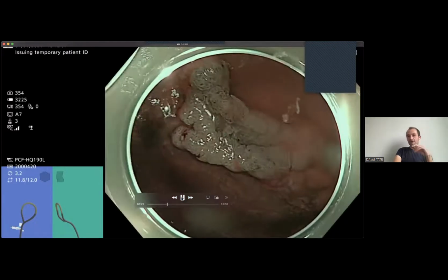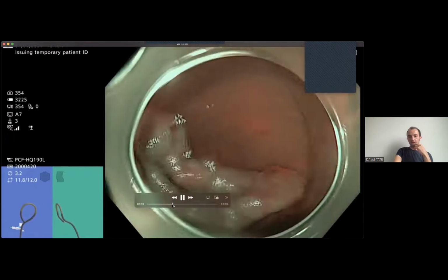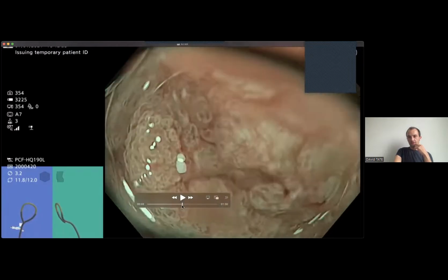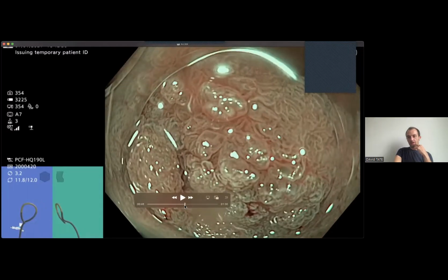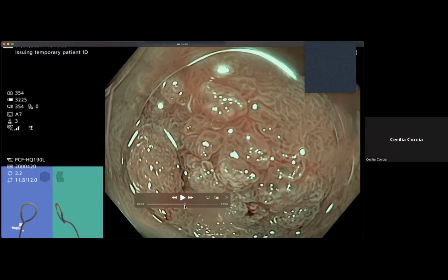Anyway, indeed we need to further image the part which looks like a depression, which could be a demarcated area. So let's get a little bit closer to that. I might just skip the video a little bit to see it. So the endoscopist obviously thinks the same as you and is trying to image. So what do you think about that demarcated area? It actually looks similar to the rest of the polyp. So let's go to the structure of what we want to talk about, demarcated areas. Is it regular? Or is it at all irregular?